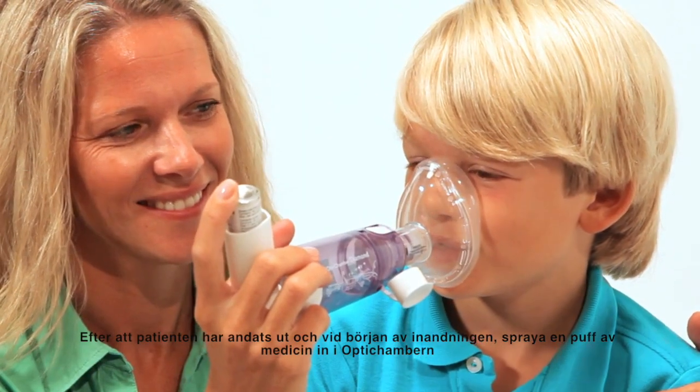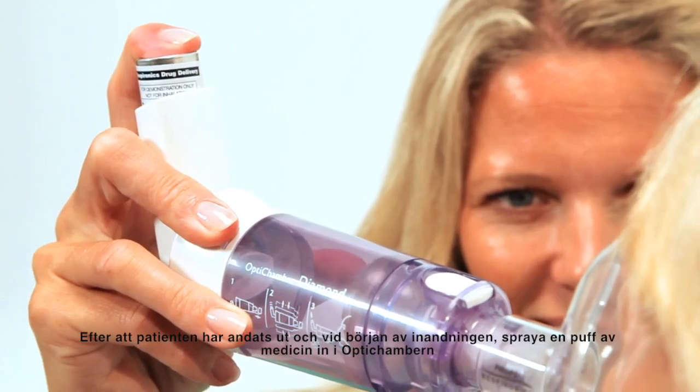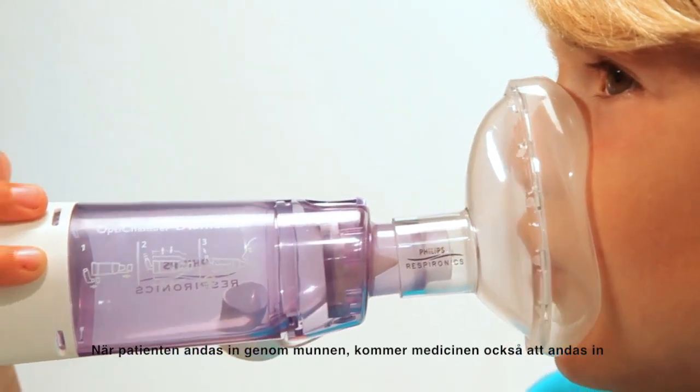After the patient exhales and at the start of the inhalation, spray one puff of medication into the diamond. When the patient inhales through their mouth, the medication will be inhaled as well.